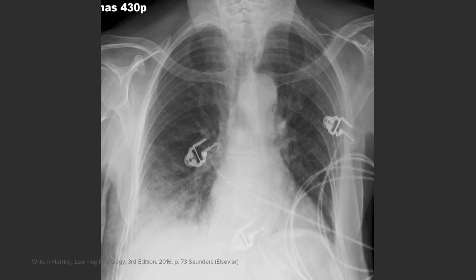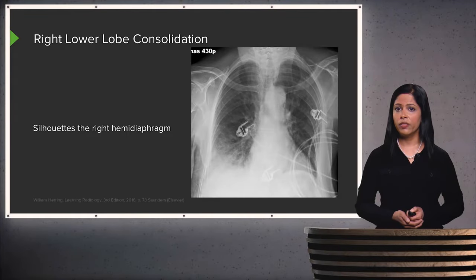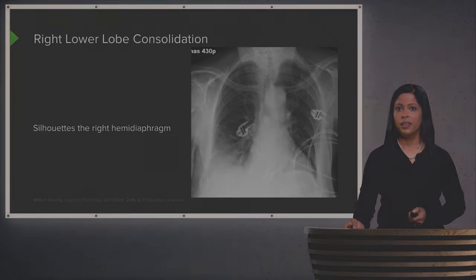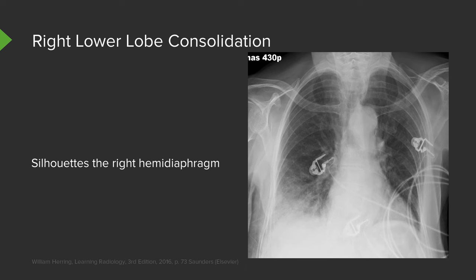This pattern shows silhouetting of the right hemidiaphragm — this is what a right lower lobe consolidation looks like. To differentiate between a right middle lobe and a right lower lobe consolidation on a frontal view: the right middle lobe consolidation will silhouette the right heart border, while the right lower lobe consolidation will silhouette the right hemidiaphragm.